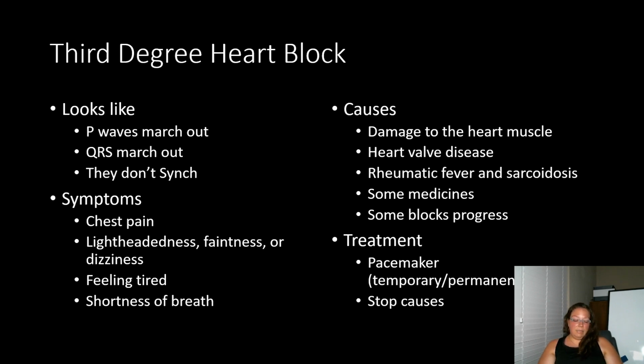You can pace these patients temporarily. It's pretty uncomfortable. What you can do is put the defib pads on them, and you can pace them through their skin. You can also, if they are intubated, do what's called a TEE pacing scope, where you put a device through their mouth and it'll sit behind the heart in the esophagus, and they can pace the heart from behind the esophagus. Just send little electrical impulses that'll make the heart beat.